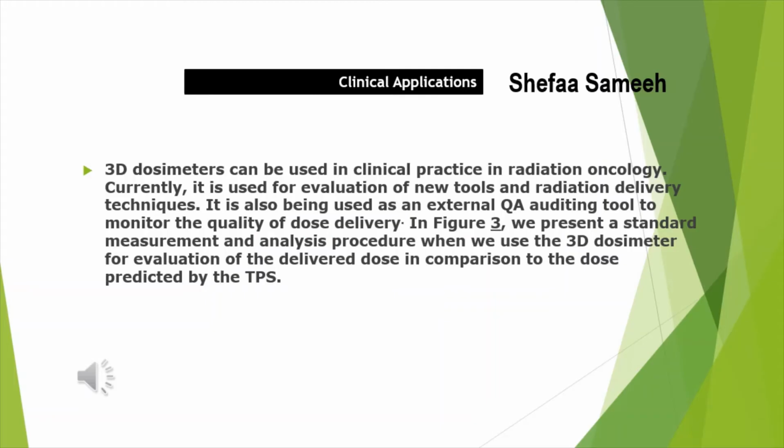In this part, we will discuss the clinical applications of the three-dimensional dosimeters, which can be used in clinical practice in radiation oncology. To be specific, they are used for evaluation of new tools and radiation delivery techniques. They are also used as an external QA tool to monitor the quality of dose delivery.